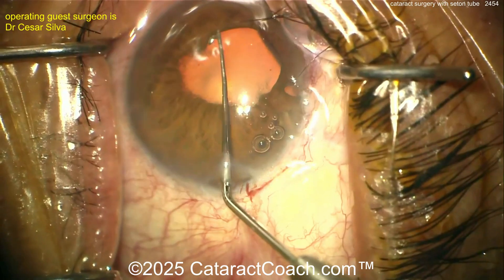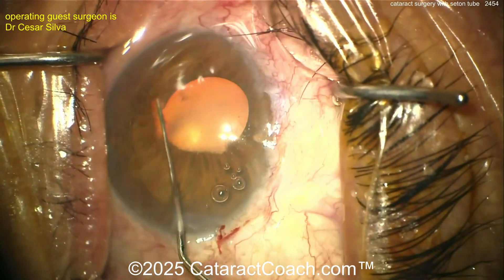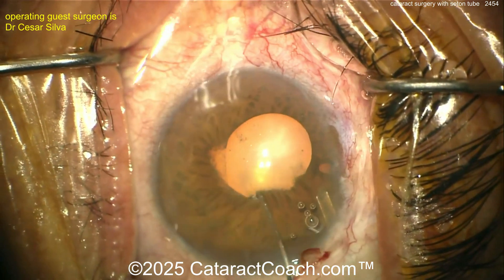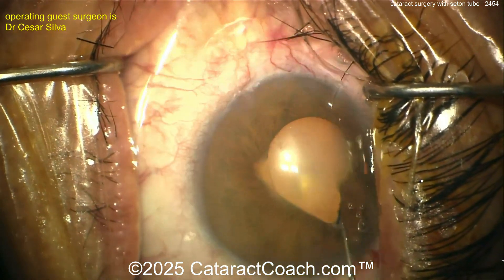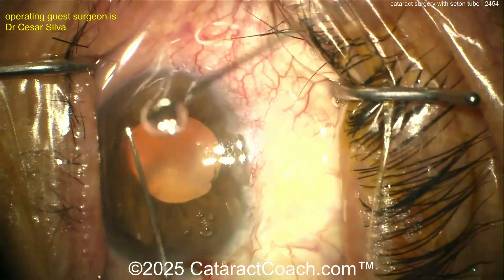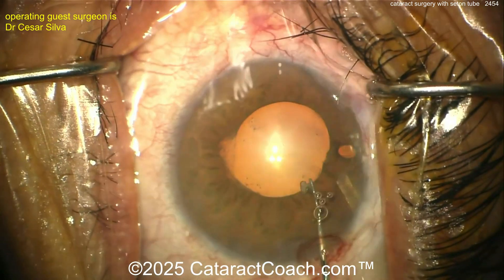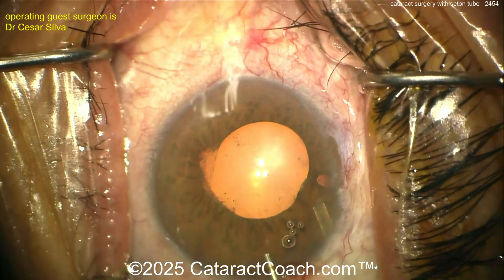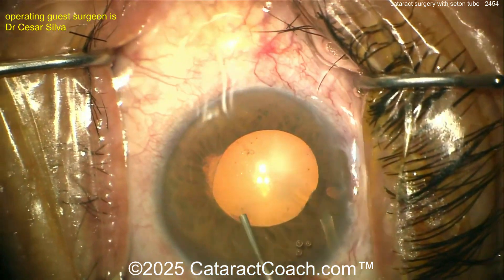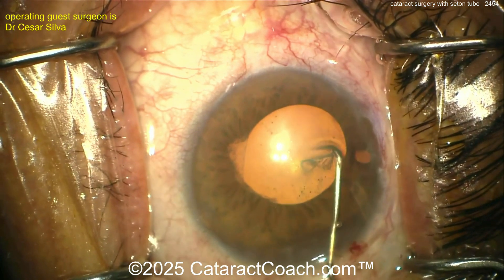Making the main decision here — we obviously need to start off by breaking those synechiae, nice and easy. I like this technique with a chopper or other second instrument, slowly peeling it off the anterior lens capsule. You can also do a little more dissection with viscoelastic if there's a membrane there. You can use your capsulorhexis forceps and grab that membrane and peel it right off — I think there's a membrane right there on your screen on the left side of that rhexis.